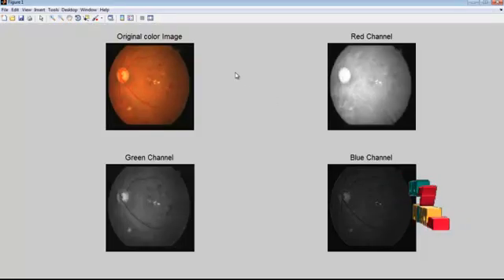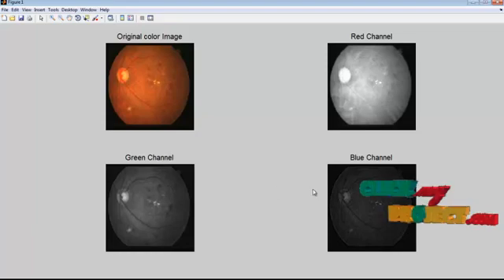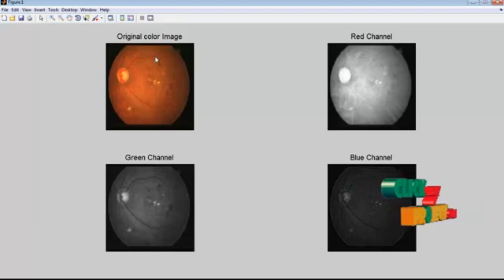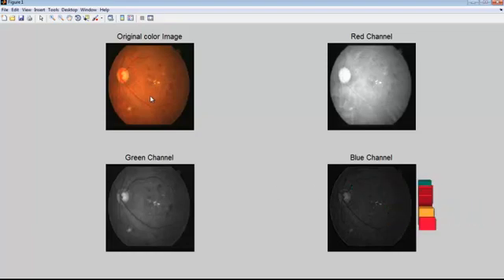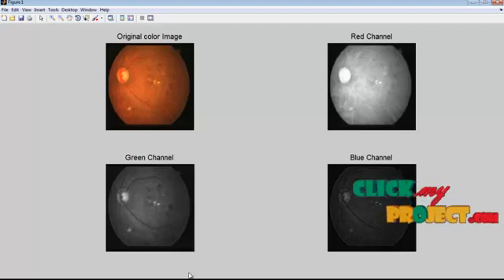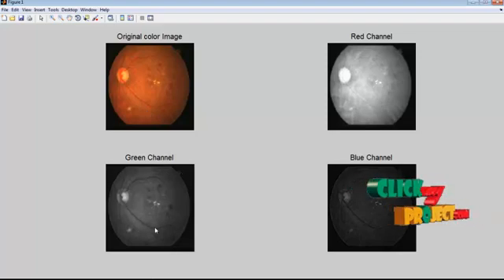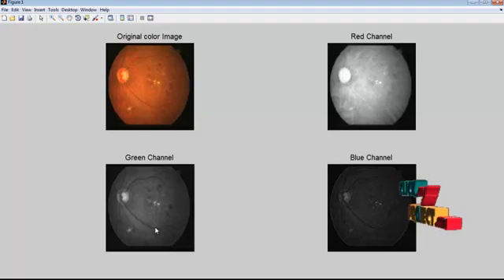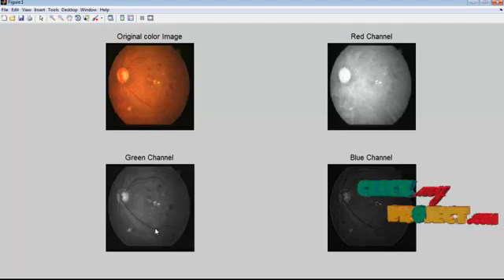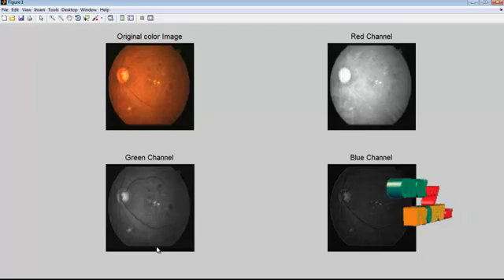This shows the corresponding red, green, and blue channels extracted from the original color image. Here we consider only the green channel, because red and blue show low contrast and are very noisy when compared to the green channel.